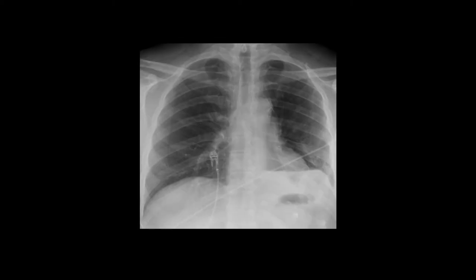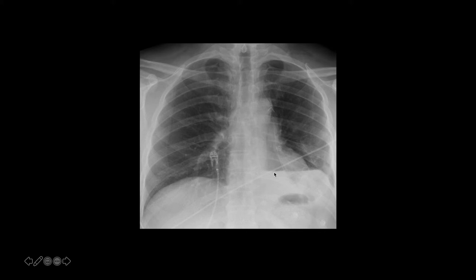Shifting gears to abnormal air collections in the thorax: here we have an air-fluid level. You should never see air-fluid levels anywhere in the chest under normal circumstances. This should always clue you into the presence of something, which is usually a hydropneumothorax as in this case — you can see the medial pleural margin of the lung. On a lateral view, the air-fluid level line would be much shorter in one view and much longer in the other, because of the elliptical shape of the pleural space, whereas air-fluid levels in a lung abscess tend to have about the same width on frontal and lateral views since abscesses tend to be spherical.